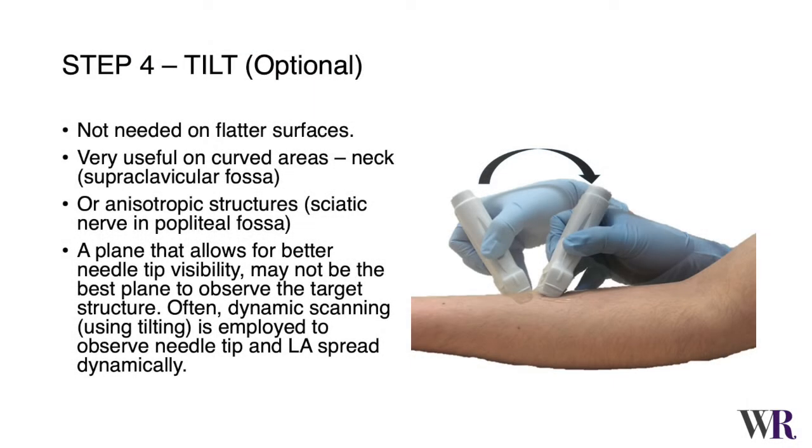The fourth and final step is that of a tilt. This is an optional step. A tilt could be caudal tilt or cranial tilt. Typically, this is not needed over flatter surfaces, however, it is useful in 2 situations.